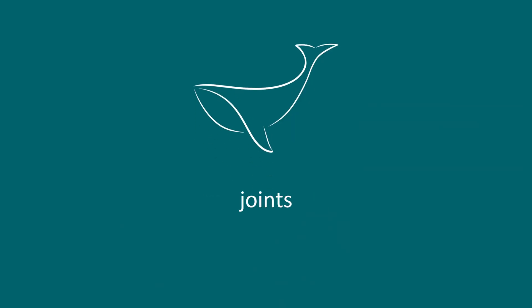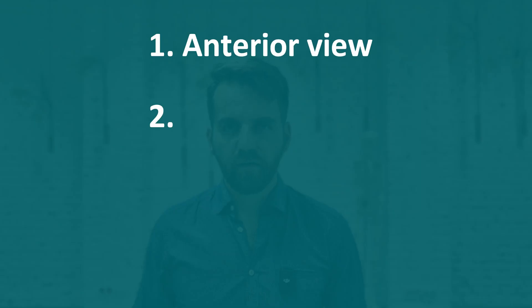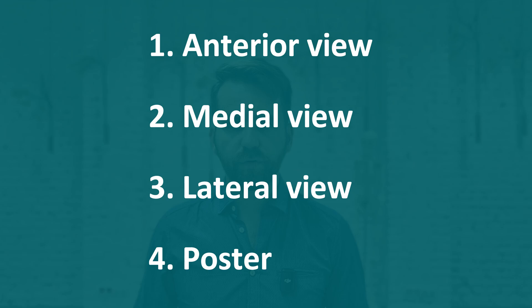In today's tutorial we will focus on the ultrasound examination of the knee. Hi, my name is Jakub. In today's video I will guide you through the basic examination protocol of the knee. I will show you where to look for joint fluid and how to identify soft tissue structures around the knee. We will examine the knee from four different views: anterior, medial, lateral and posterior.